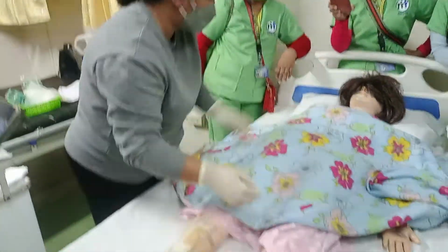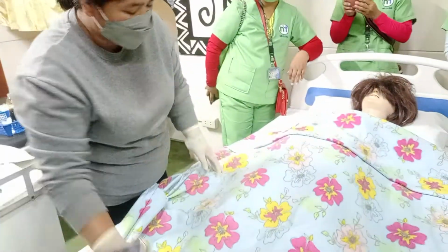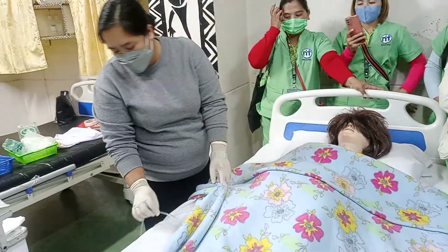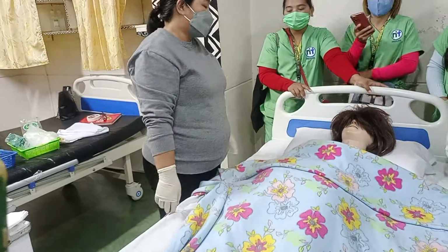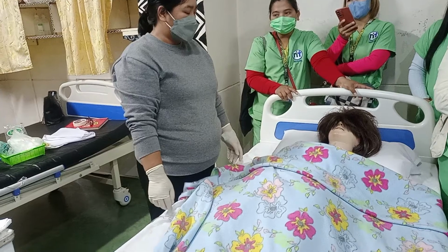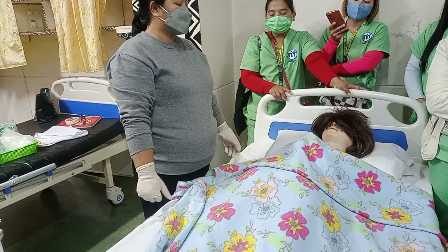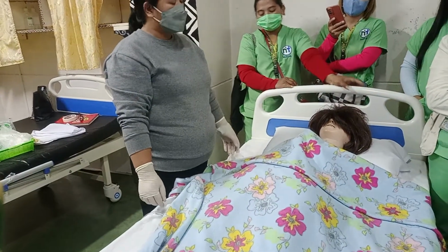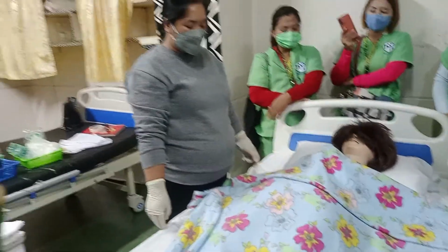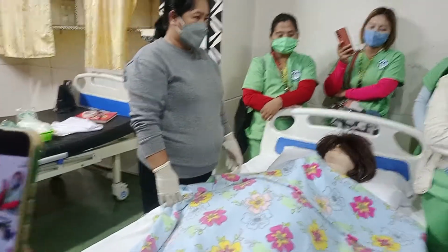Okay? And then explain what to expect. So what to expect? Ganito. So, Mrs. Smith, now that I inserted the catheter, I can see that the urine is freely flowing. If you feel like you want to urinate, please do not hold your urine. Just relax. Breathe in, breathe out. Hold your breath for at least 3 seconds. And then let go again so that your urine will pass out. Anyway, you are already in your urinary catheter. Hindi na po kayo maiihi sa kama.